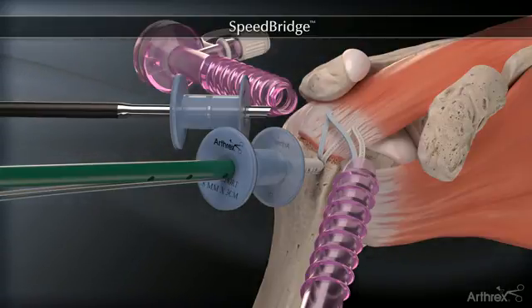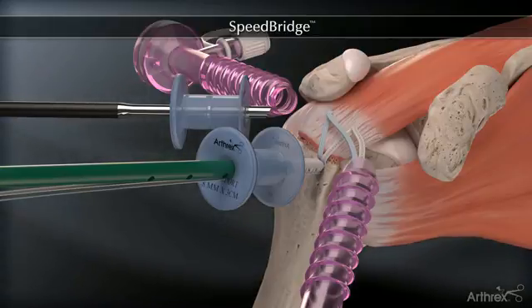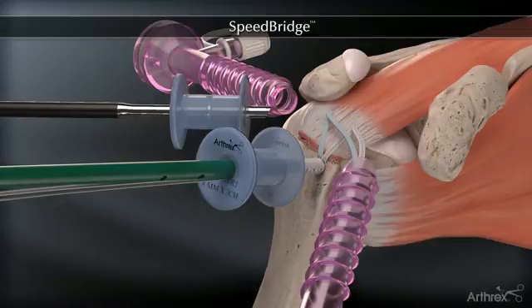If it is determined that the tension is not adequate, the driver can be backed out and tension readjusted. Insert the cannulated and vented biocomposite swivel lock anchor.